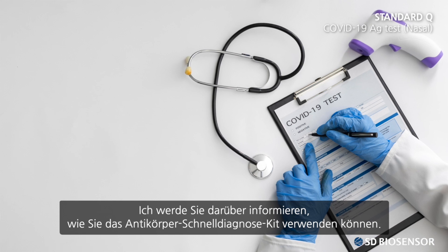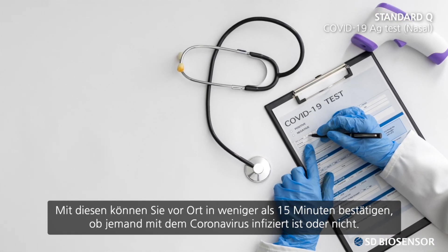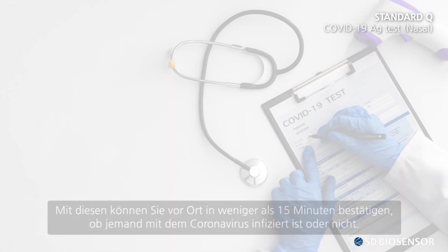I will be informing you on how to use the Quick Antigen Diagnosis Kit. With it, you can confirm on the spot whether someone is infected with the coronavirus or not in less than 15 minutes.